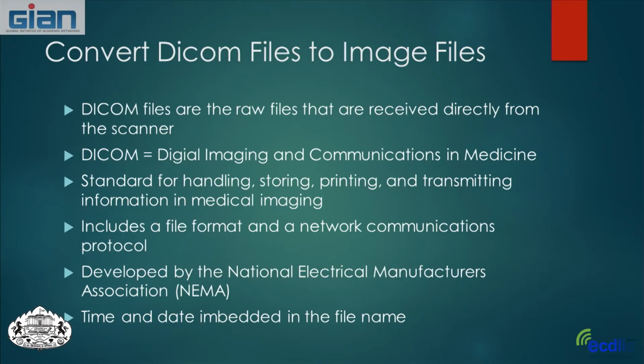Okay, so like I mentioned, the first step is to convert the images. Nowadays, the scanner does the Fourier transform for us. So the images that we actually get now are already Fourier transformed and in the form of brains already. However, the raw files that we get from the machines are called DICOM files.